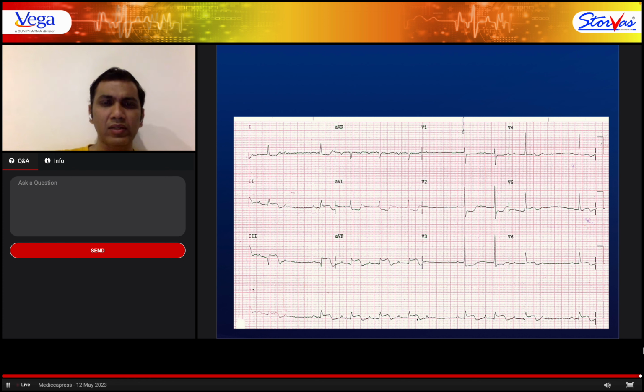So let's take a look at how you want to evaluate this ECG. Looking at the P wave, it is positive in lead 1, it is positive in lead AVF, and if you look at lead V2, it is positive there too, suggesting that this is a sinus node exit of the P wave. Now every P wave, unlike the last case, is not followed by a QRS.